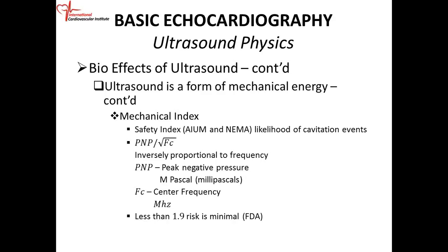So the greater the frequency, the lower the MI, mechanical index, and the lower your frequency, the greater the mechanical index.